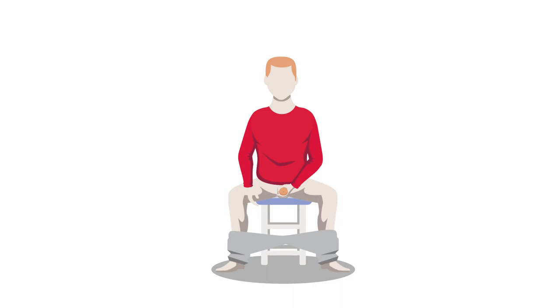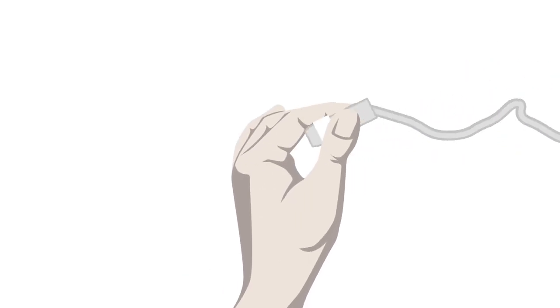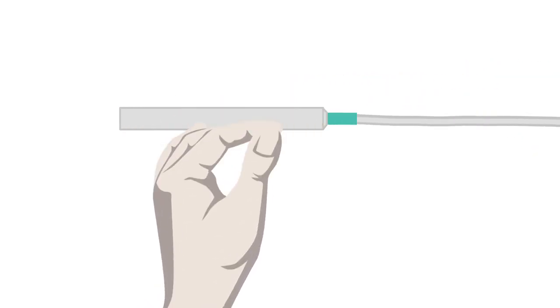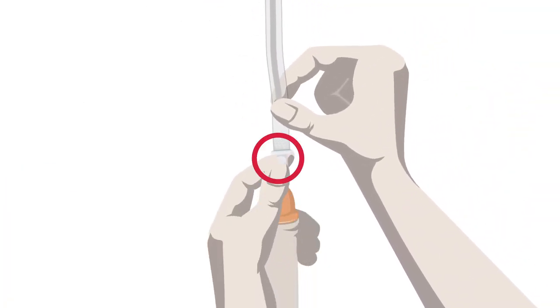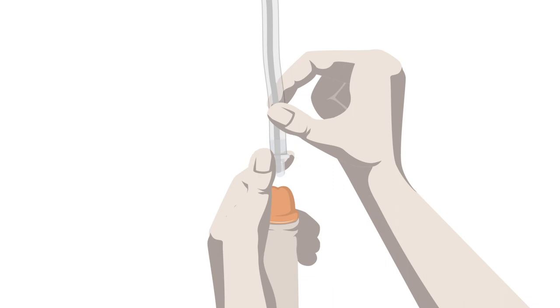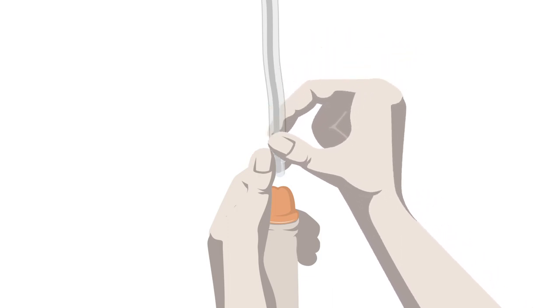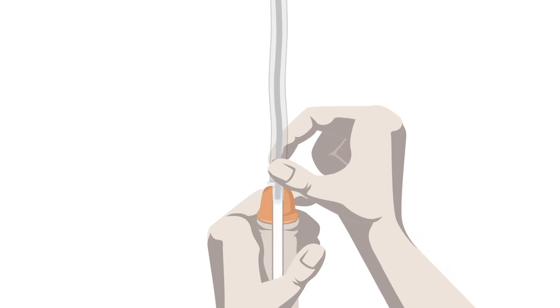Now you are ready to use the VaPro Plus pocket catheter. Take the catheter. Unfold the integrated urine collection bag to enable the urine to flow into the bag. Remove the cap from the protective tip of the catheter. Advance the catheter into the protective tip, ensuring that it does not protrude. Grasp the catheter with your dominant hand below the protective tip plate and insert the protective tip until the base comes into contact with the urethral opening.